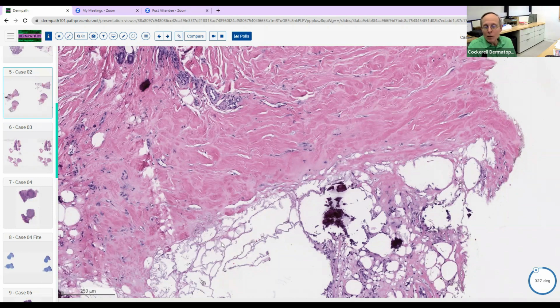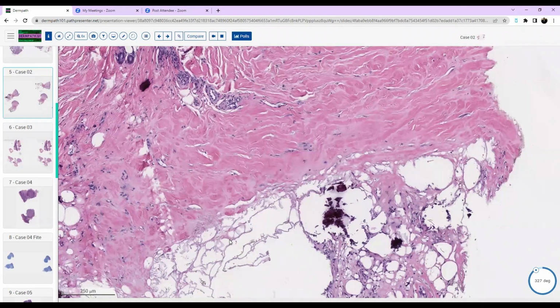It's calcium stearate that forms inside the individual lipocytes, and it sort of calcifies and looks like a little tiny bar of soap, if you will. So this isn't really saponification. This is more, like you said, dystrophic calcification here. And then along that route, potentially also calcinosis cutis. But for that, I would expect the calcium deposits to be more in the dermis and not in the subcutaneous fat. Although I guess they could potentially be in the subcutaneous fat as well.